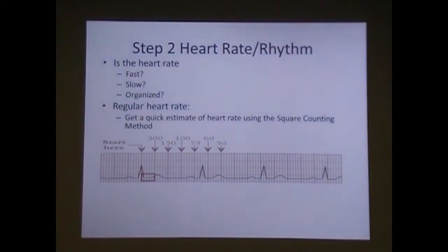One of the things I was talking to my wife about, she was looking over this PowerPoint for me, looking for grammar errors. And she pointed out on some of the peaked T waves, the first, and I do this too, is I love when it's saying I have a 250 heart rate. Because the machines aren't that bright. If it's tall enough, it's going to count it as a QRS.